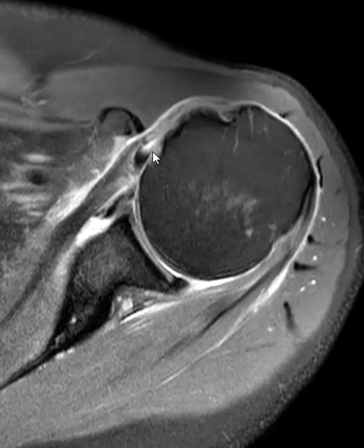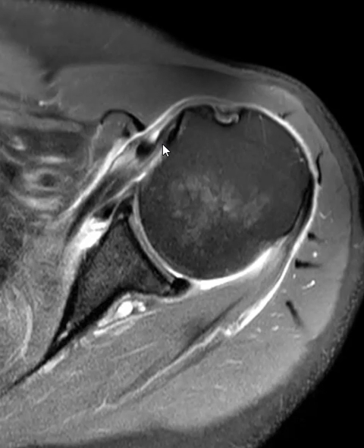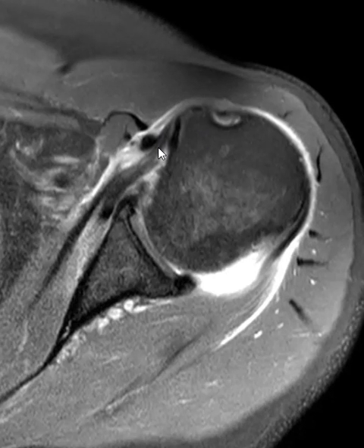You can see some fibers are superficial here. If we go down lower, some of the fibers are deep. So this represents a tear of the subscapularis tendon and associated dislocation of the biceps long head.